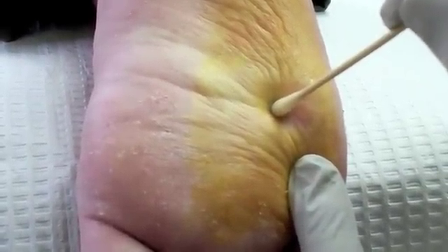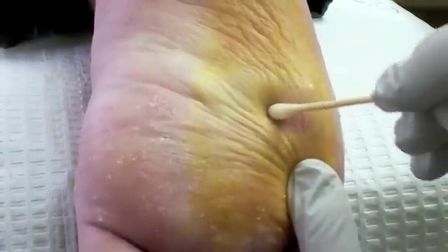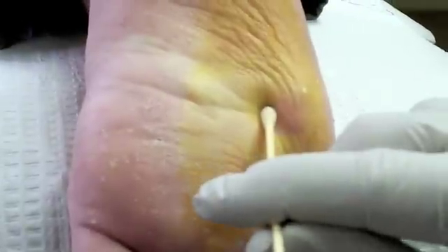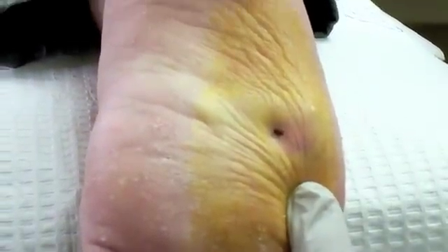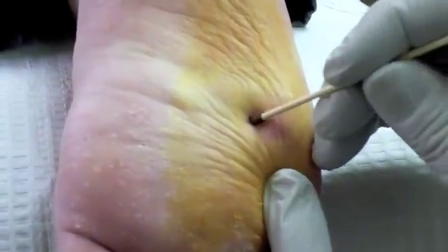We're going to be very careful where we put this phenol — only on our surgical site. We don't want it dripping anywhere else. And then we're going to use a silver nitrate stick to cauterize the area so it doesn't bleed.